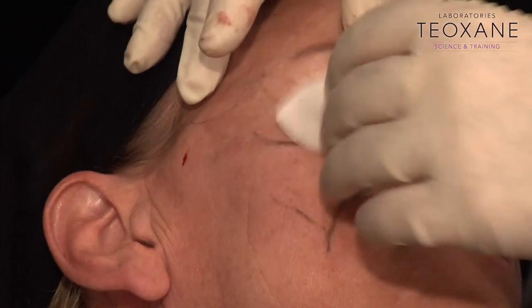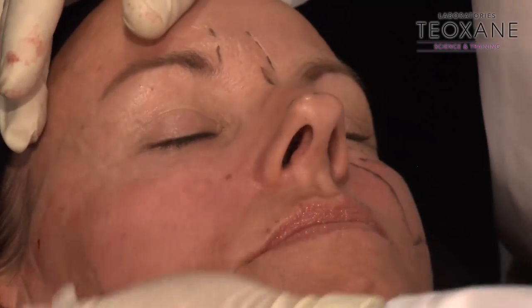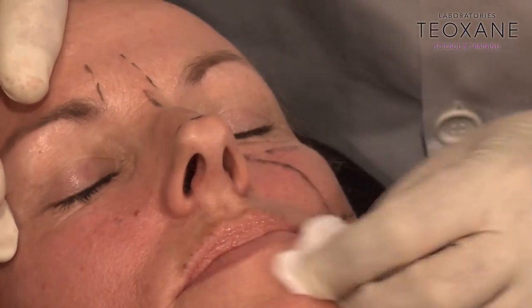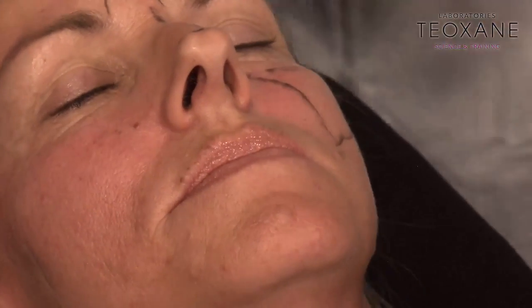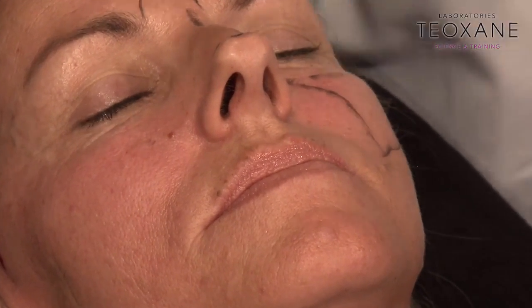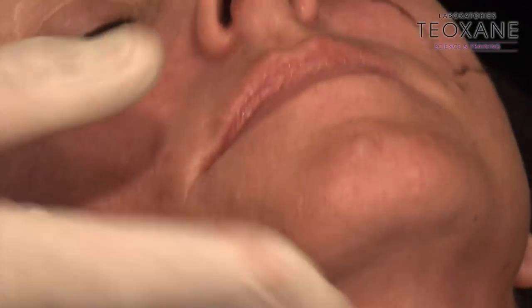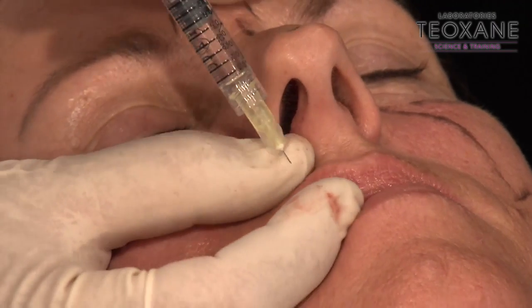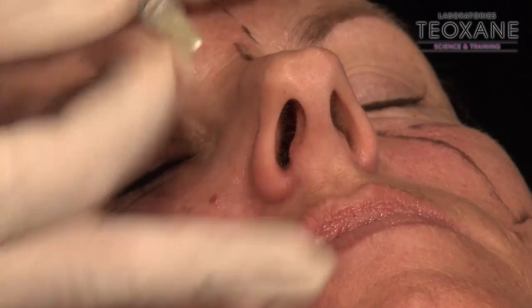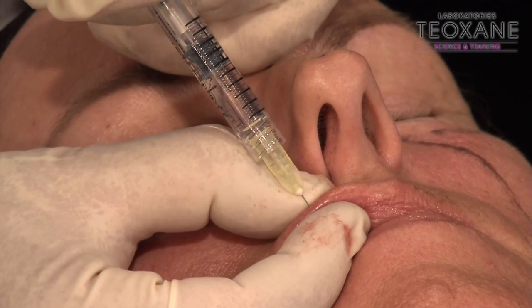Alors, now we are turning around the lips. I'm going to do the outline this time. RHA2, short needle. I check that everything is going properly. She has a lovely outline, should be easy, technically. Okay. I pinch the outline, if you notice. You see, my right hand is always working. She does 50% of the work.